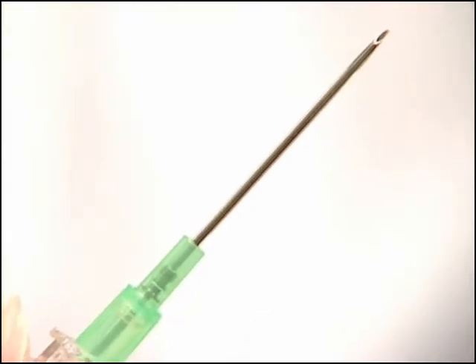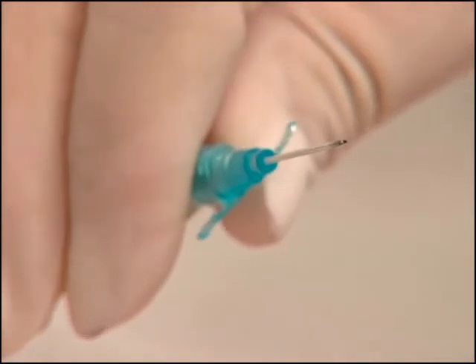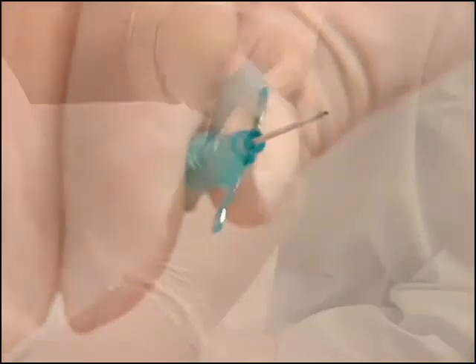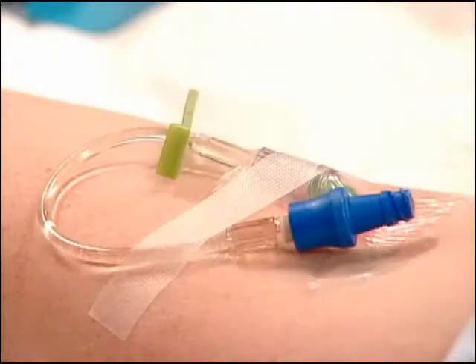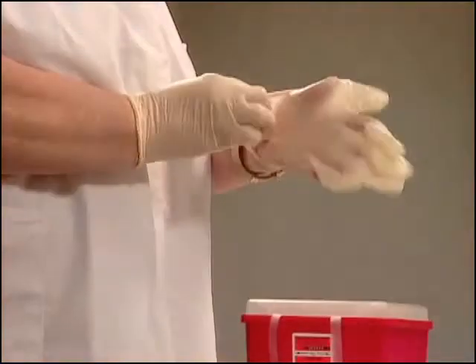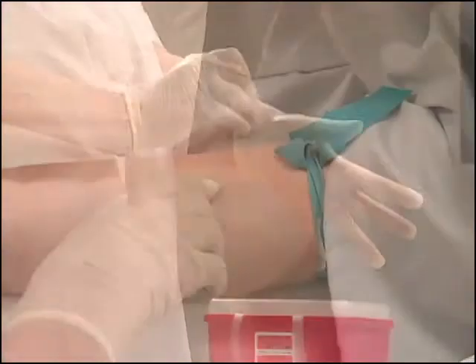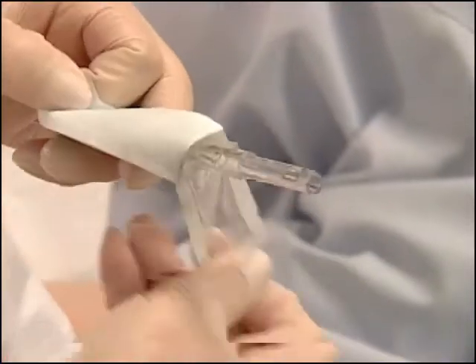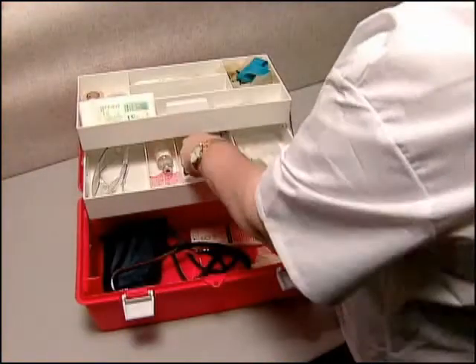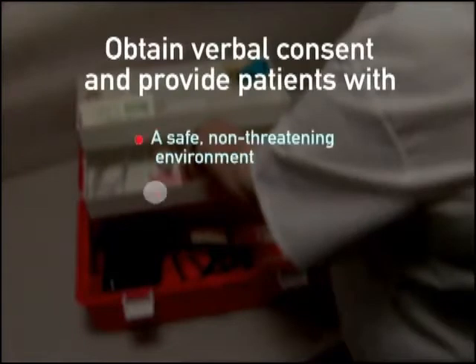Catheter insertion into a vein is generally done for one of three reasons: to replace fluids, to give medications, and to repetitively draw blood for testing purposes. Practitioners should be aware of local protocols and follow them at all times. Your goals are to create a safe, non-threatening environment and to gain consent for the procedure whenever possible.